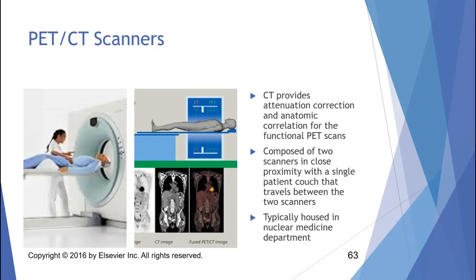Okay, and then lastly, PET and CT scanners. I worked on the Siemens Biograph 16 PET CT scanner, which means it's a 16 slice scanner. So we didn't do big angiography scans or heart scanning on it, but it can do pretty much anything else. Okay, we even did runoffs on it. If the patients refused to go downtown, we would still do them. So it's a very decent diagnostic CT scanner.